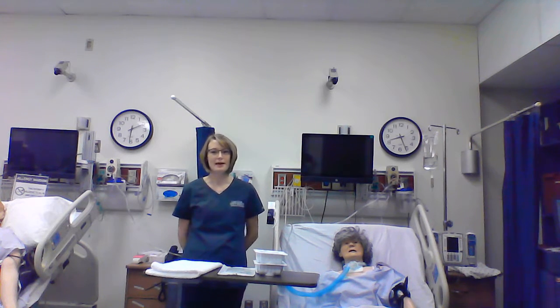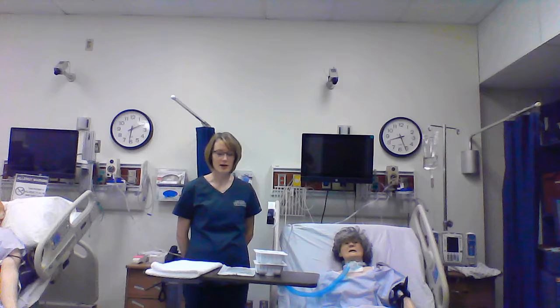My name is Tracy Cundiff. I'm an 8th semester nursing student, and today I'll be performing trach care for a patient.